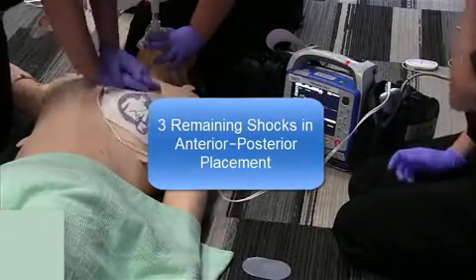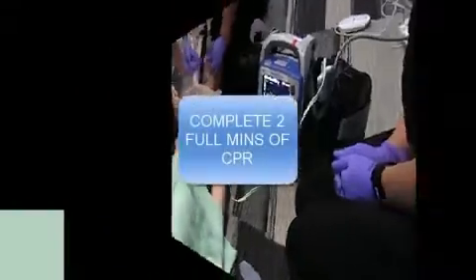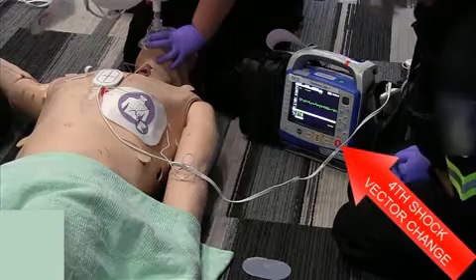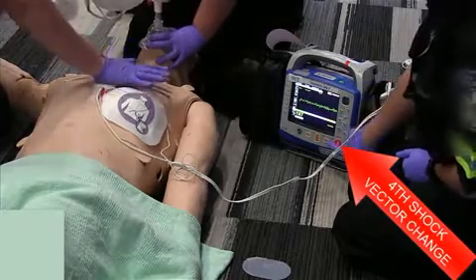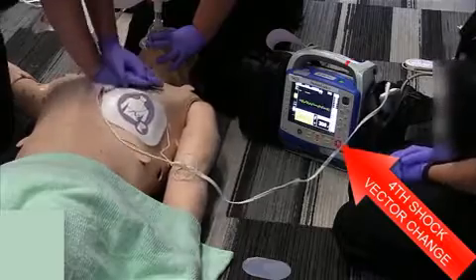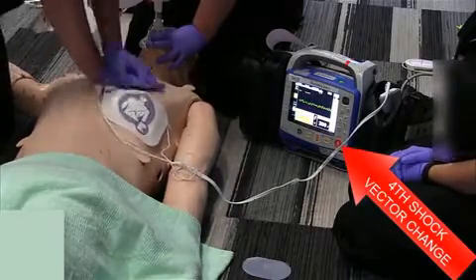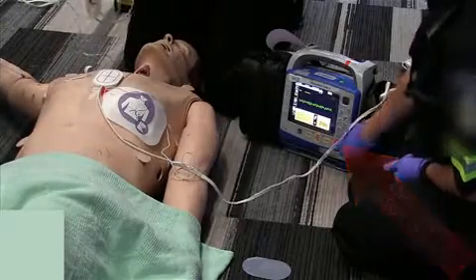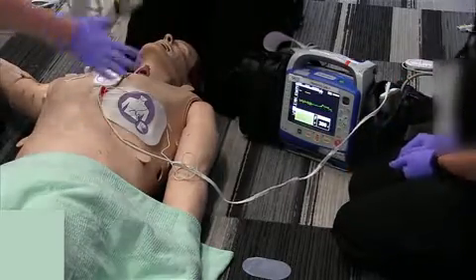25, 26, 27, 28, 29, 30. Stop CPR. We're doing our fourth rhythm analysis. It's VF. Continue CPR. Charging again to 200. Okay, stop CPR. Everybody hands off. Shock delivered. Continue CPR.